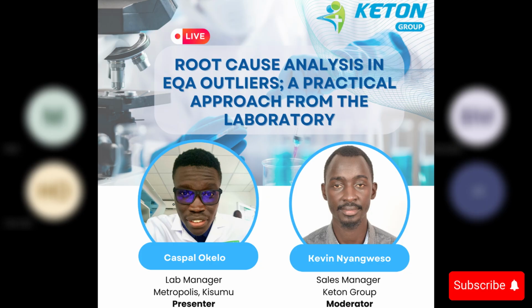Then as a lab, you develop your key performance indicators. You check for reduction in repeat errors, maybe percentage reduction across a year. I need less than 0.1% in repeat errors. A decrease in instrument downtime, fewer NCs related to the same issue.